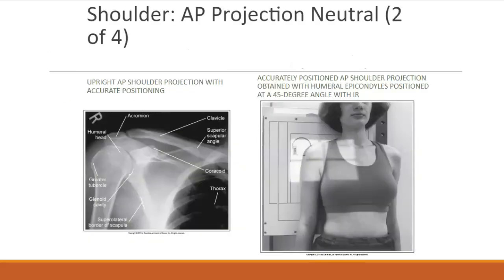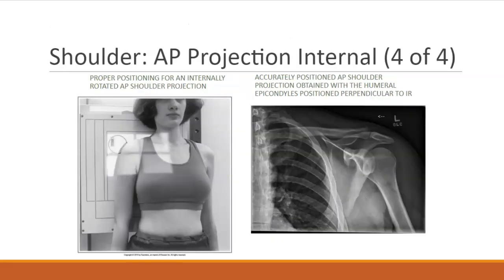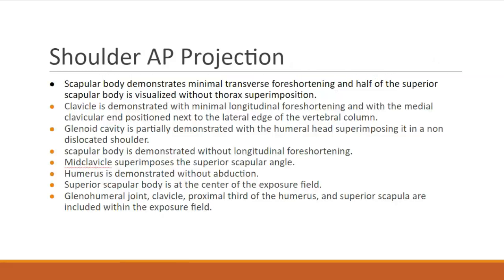The next couple of projections are demonstrations of the AP neutral projection of the shoulder, the external projection, and the internal projection. I will include the image analysis guidelines for your review on your own time.